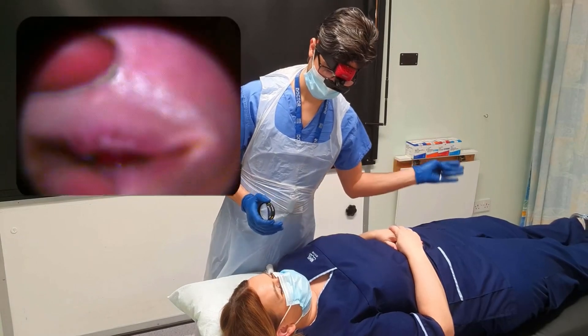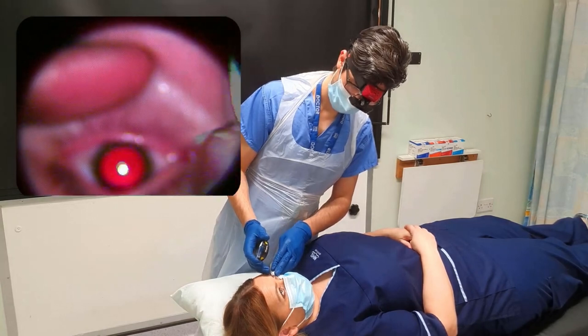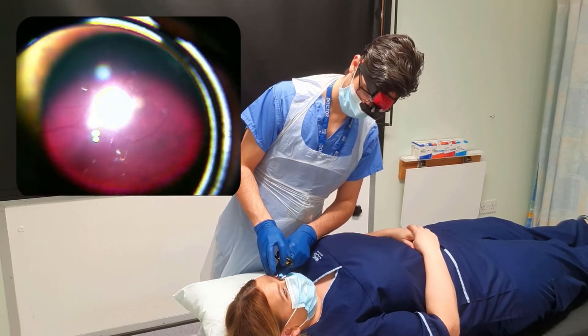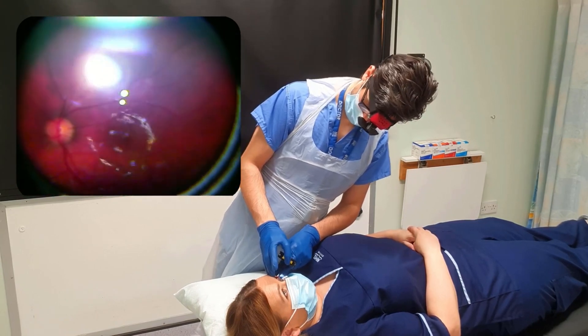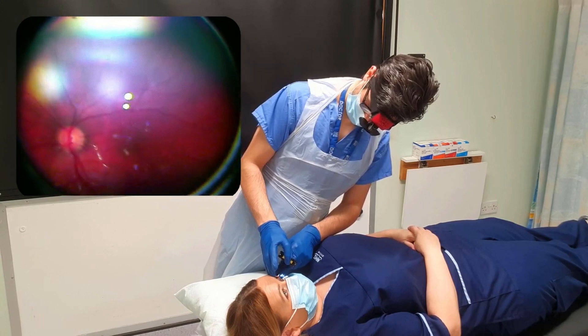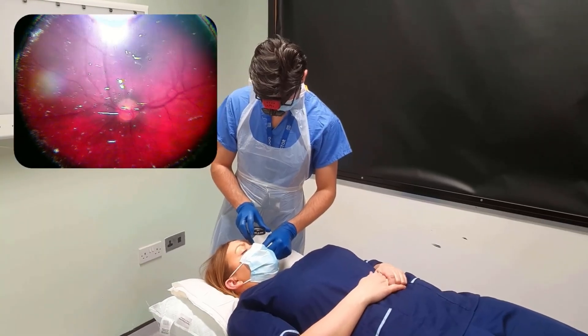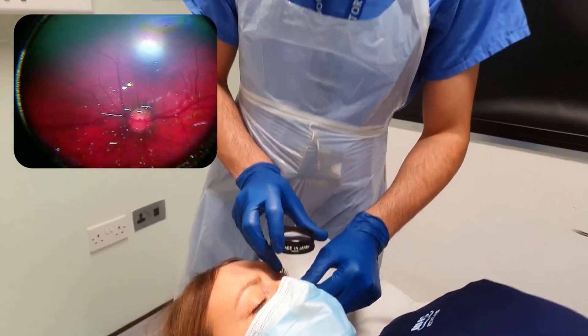Stand at the head of the patient. Adjust the bed or chair height to ensure both you and the patient are comfortable. Angle the light source towards the patient's eye and examine the red reflex. Then use a condensing lens to bring the posterior pole into view. You can gently rest your hand on the patient's forehead for stability. Ensure that the patient's eye is in line with your light source and condensing lens. You will have to move the lens to bring the fundus into focus. It takes practice to keep the fundus in view and to become comfortable finding the working distance of the lens.